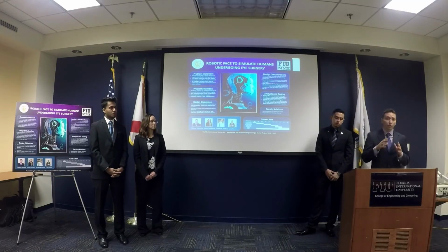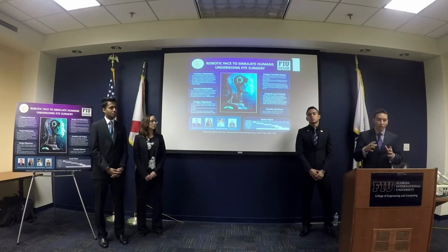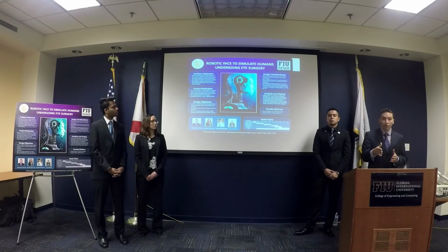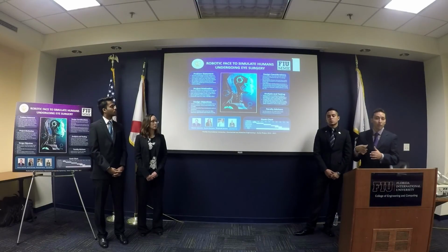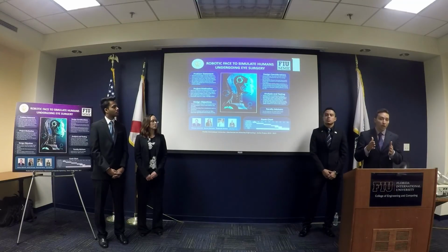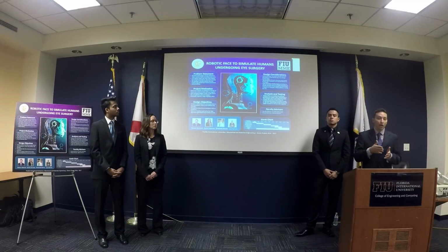No, we want to pursue this. Our main goal is to make it realistic, and remember the prototype is to train the ophthalmologist. They want to use this prototype to test the actual machine they're going to use to perform eye surgery. What they want to see with this prototype is what can go wrong. That's why we have the eyelid movement, because like you said, sometimes it doesn't move. But if it does, what can you correct from that?